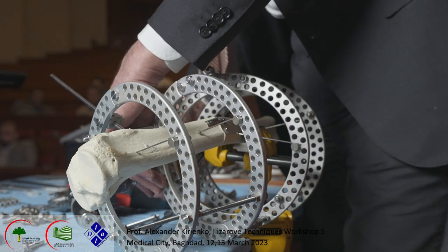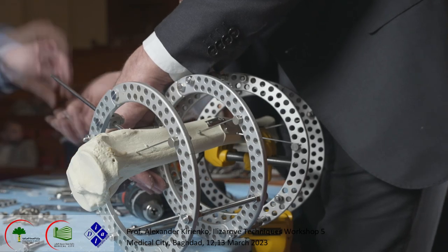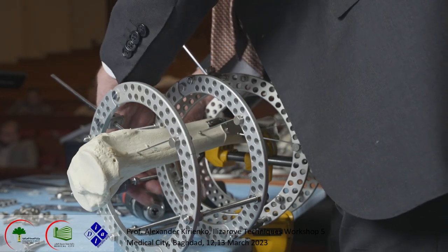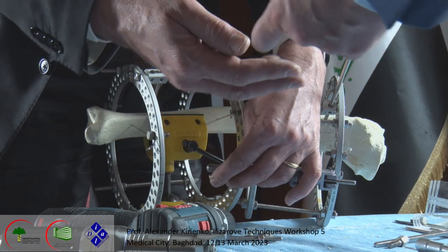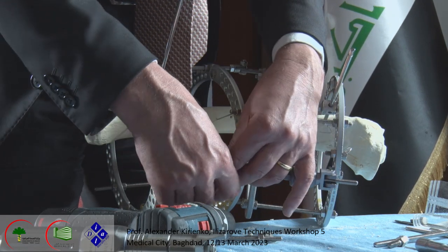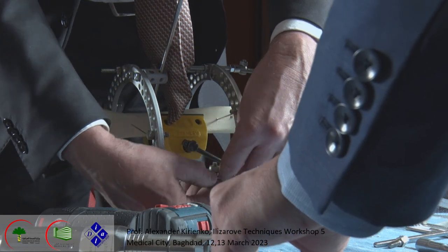Yes, here I may put, for example, a 2-hole female post. Okay, like this. We have only one plane of deformity. We don't need to put biplanar hinges. One spacer maybe here. Yes. Like this. Okay. And this is some kind of hinge.